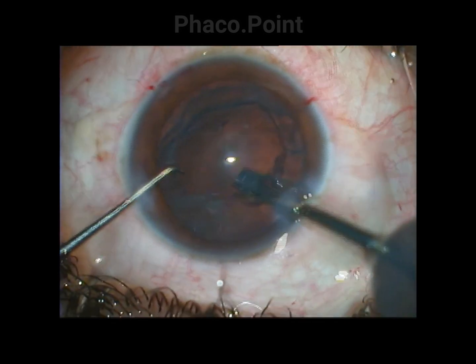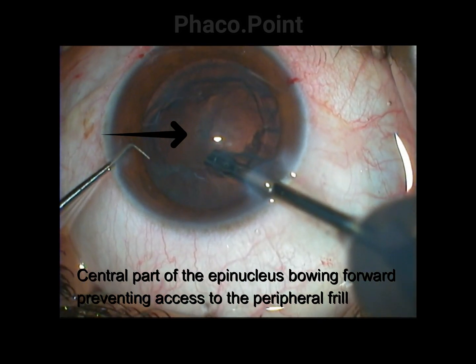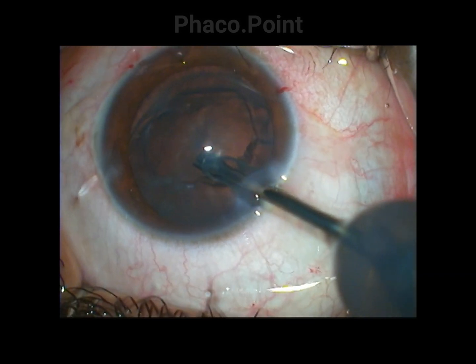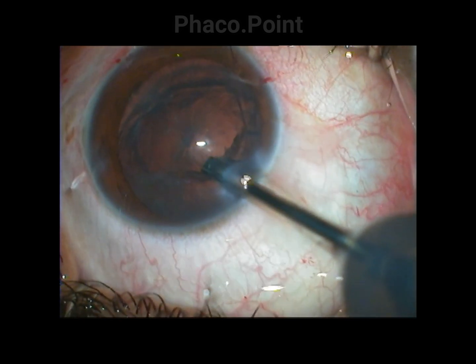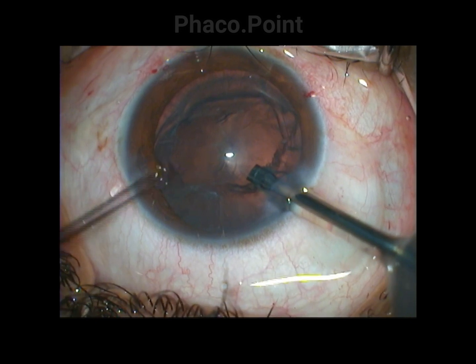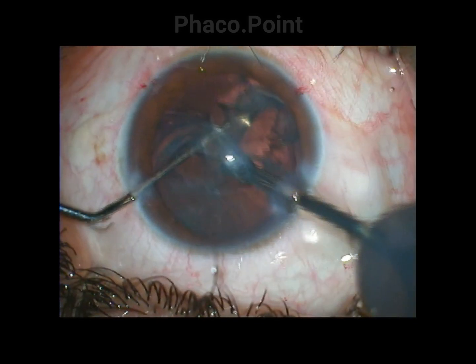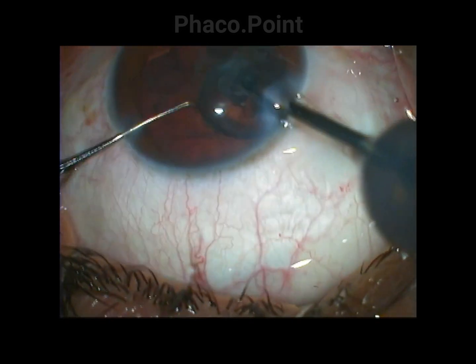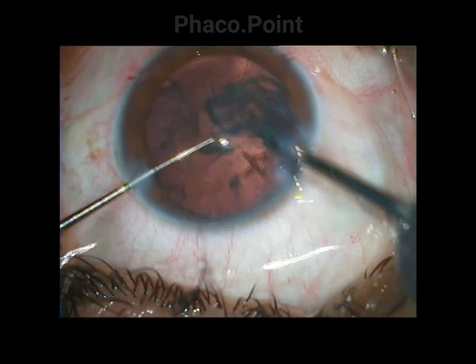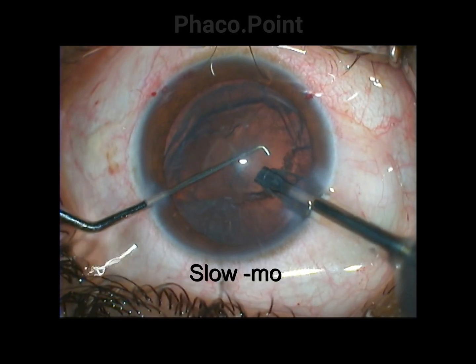Another case is one in which the epinucleus center is rising, which prevents me from grasping hold of the edges of the epinucleus shell. In this case, I am pressing down the center of the epinucleus shell so that the whole thing folds on itself, which is just opposite to the previous case, and I am able to completely remove this epinucleus plate.